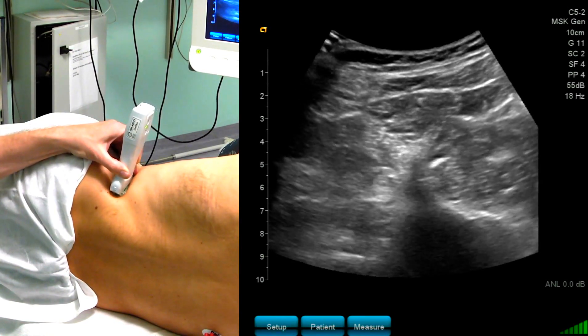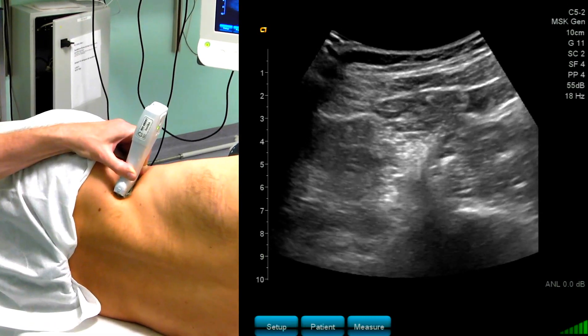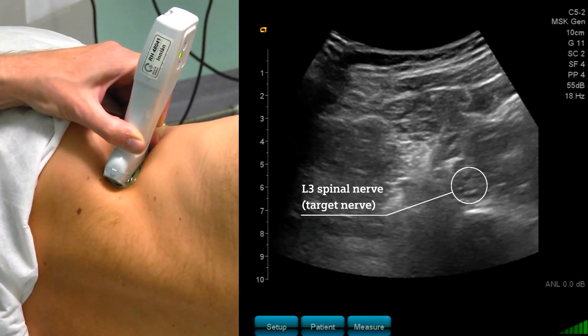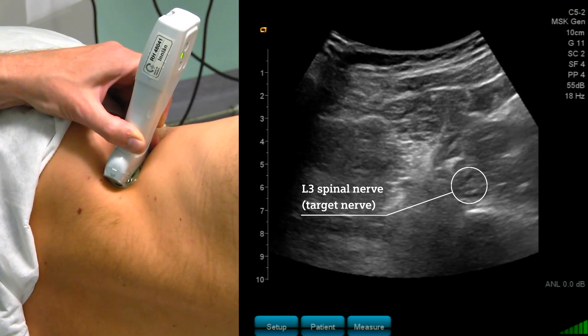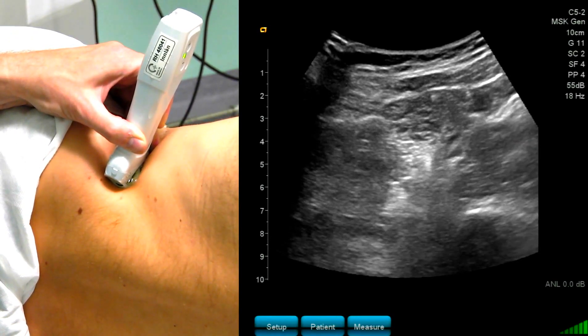And again I try to visualize the nerve. It is not as bright as before, but still I can easily identify the L3 spinal nerve. Quite frequently we can also see a tiny artery pulsating on the medial side of the nerve.